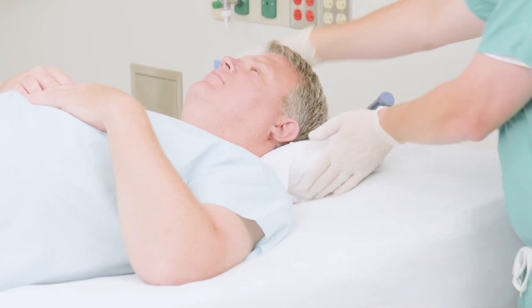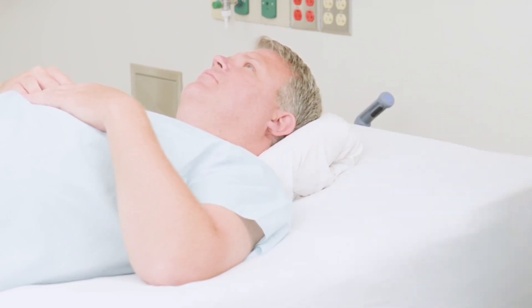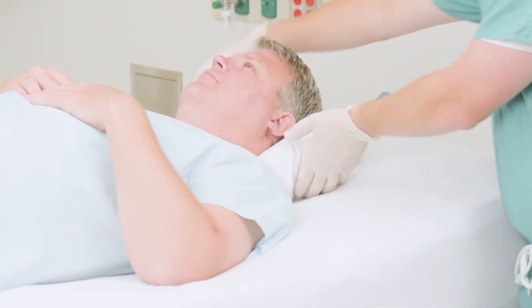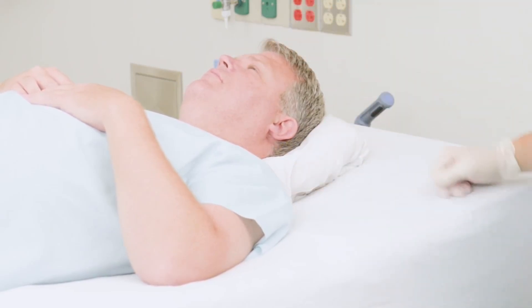Continue using the flat part of your hand to mold the positioner up and around the sides and top of the head. Finally, use your thumbs to push down to create a pocket for each ear to protect that vulnerable skin.